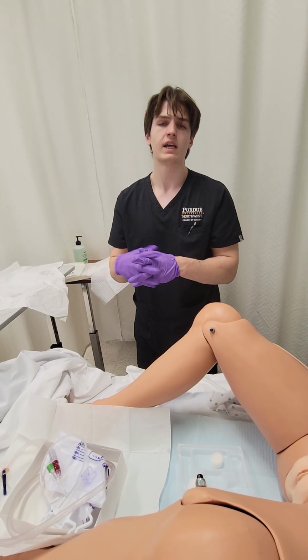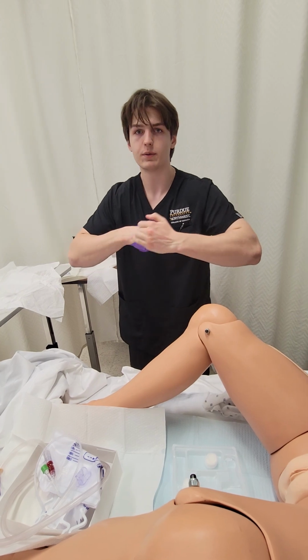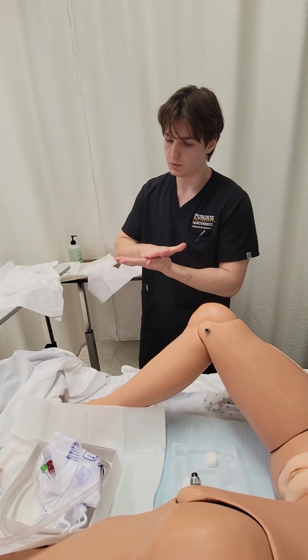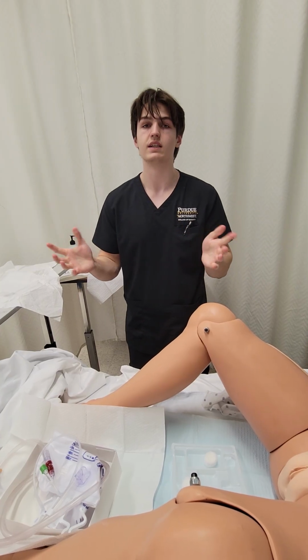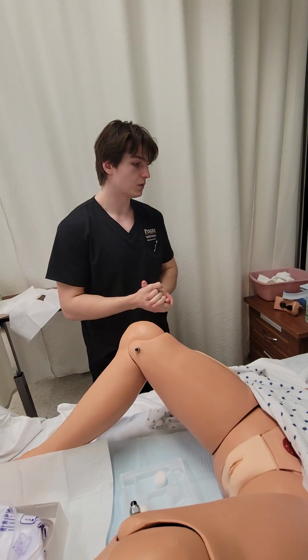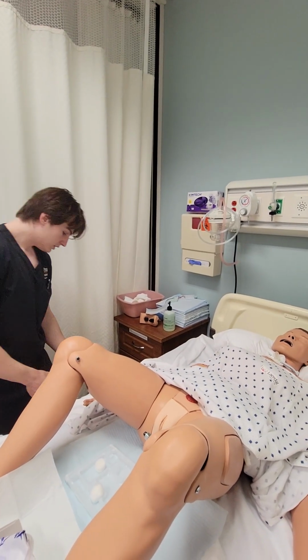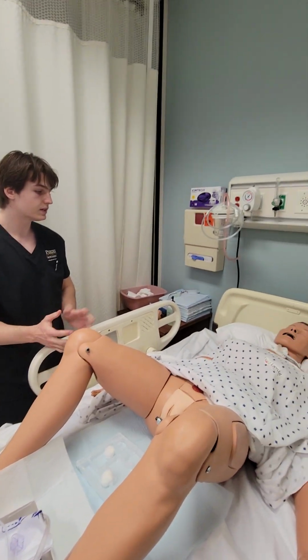At this point now, I would change my gloves since I had just dealt with the catheter and don't want to spread urine everywhere, and perform hand hygiene, and then gather up all my used materials, discard what is meant to be, and then give them the necessary resources that they need to do their own pericare. So, if there's anything else that you need or want to ask of me, now would be the time. If not, your call light will be nearby, so then you can just let me know. I will raise the bed rail and then start removing everything. Thank you for your compliance.